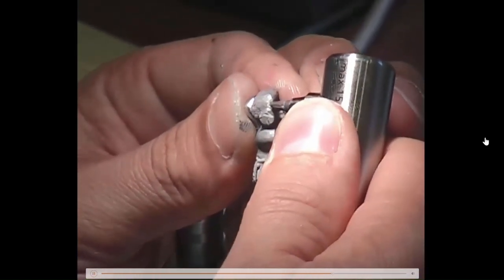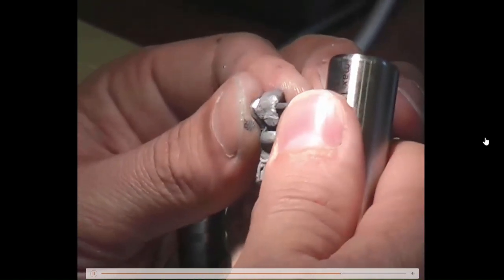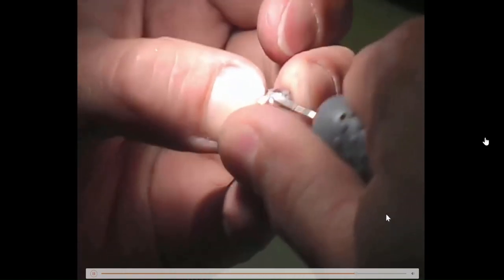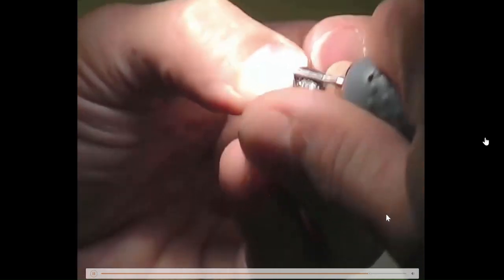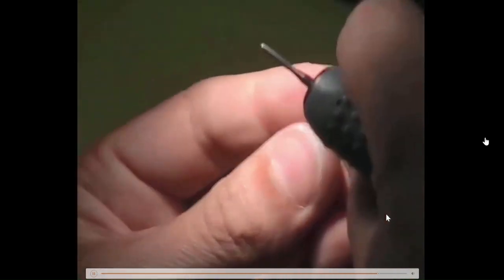This is probably the most precise dental work that we did in the lab. It required the maximum of precision. And then, yes, slowly we would trim the margin of our removable part, make them sit and fit together.